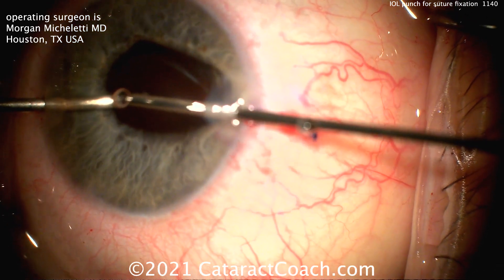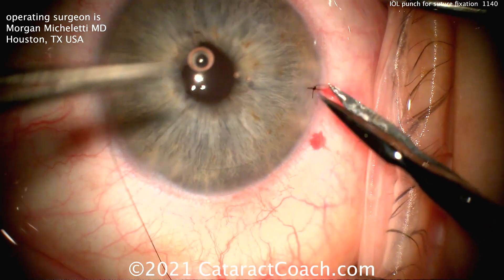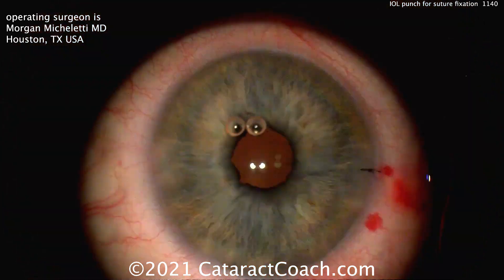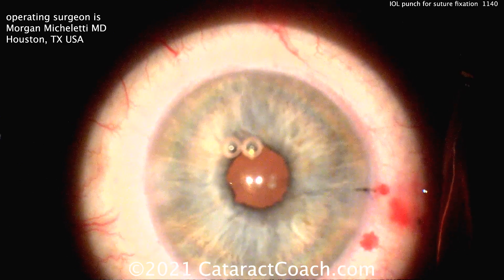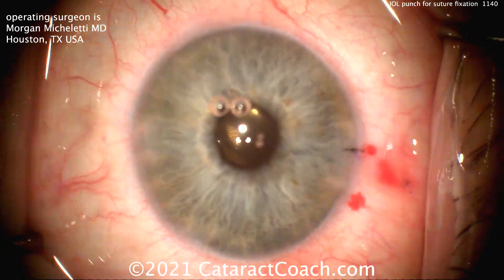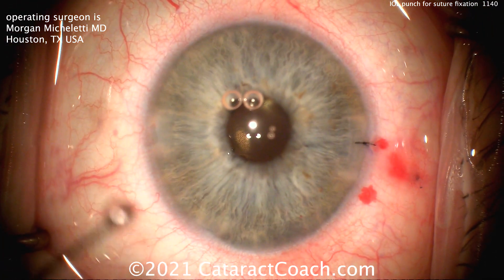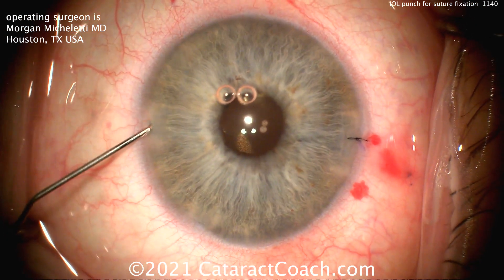This patient is going to have a beautiful result — a very simple and less traumatic way of addressing this type of complication. There's a suture at the end to close the incision and the lens is beautifully centered. The prolapsed vitreous is cleaned up with a bimanual anterior vitrectomy, and the central rings of that multifocal lens are beautifully centered in the pupil.